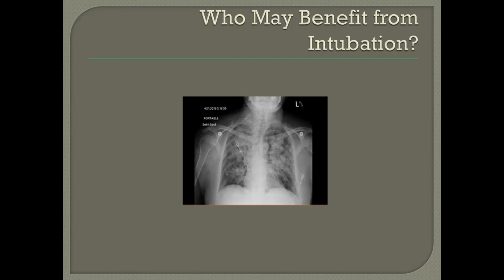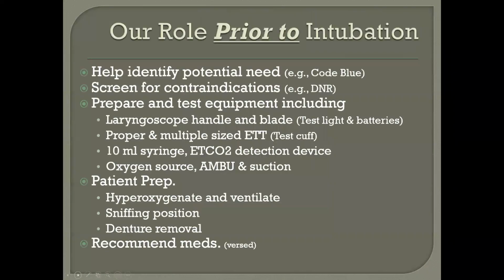If the patient can't be settled down, if we give them medication but maybe they have a high tolerance and cannot be adequately medicated through sedation, they may need a rapid sequence intubation. They're sedated, they're paralyzed, and the tube is then put in. Those are all things that we're involved with. Looking at the chest X-ray is part of that as well.